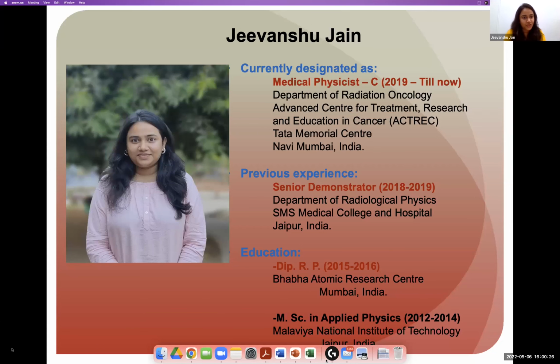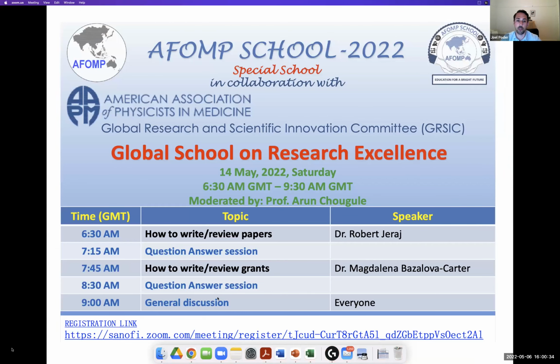The last question that we have here is, for verification of brachytherapy on Monte Carlo simulation, can we use gamma index or GPR instead? I think gamma index would be great. You know, I think a gamma index potentially with a 1%, one millimeter, something along those lines, when you're comparing a Monte Carlo versus a treatment planning system, that would be really great. I think that would be a good approach.